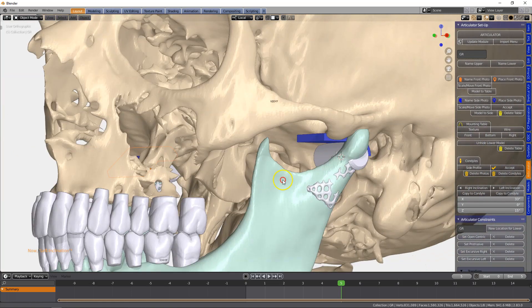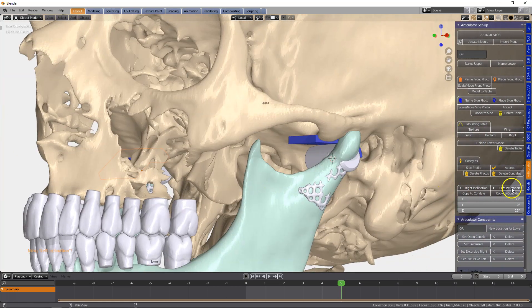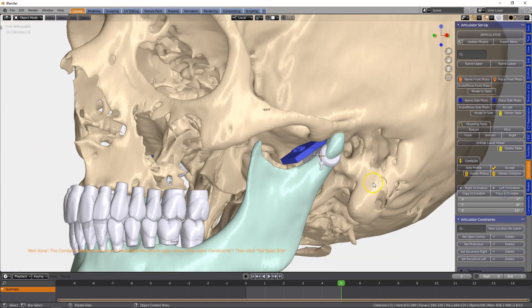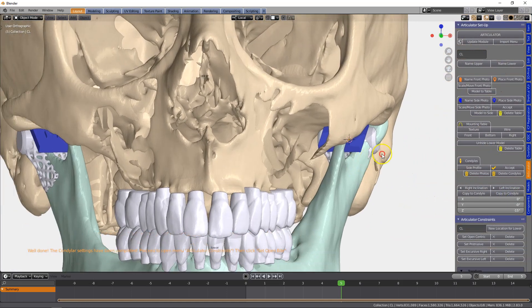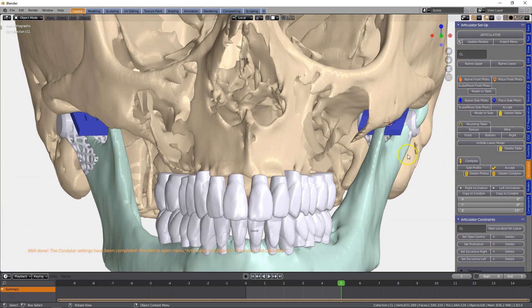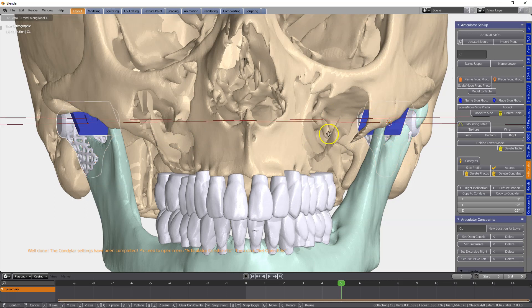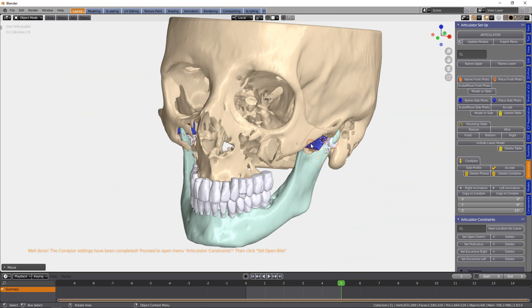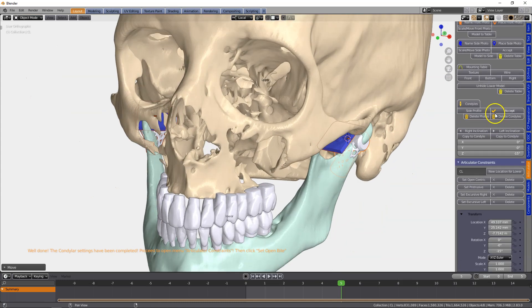We're going to copy this and these rotations to the white condyle, and this seems quite good. I will reposition the condyles a little bit to the right-hand side. That's good.